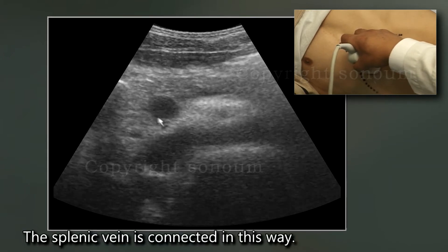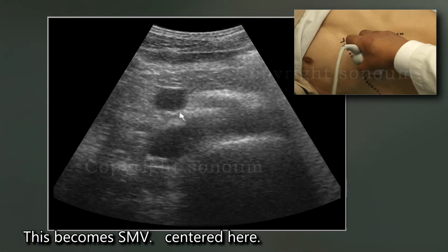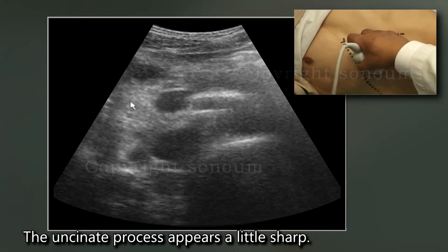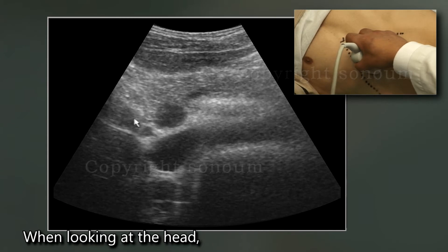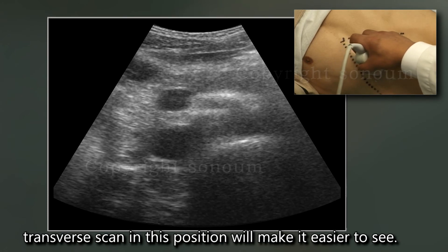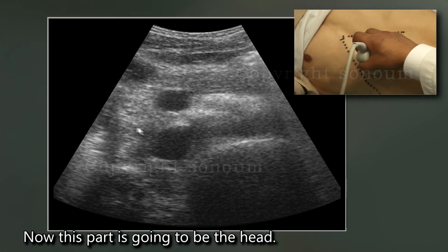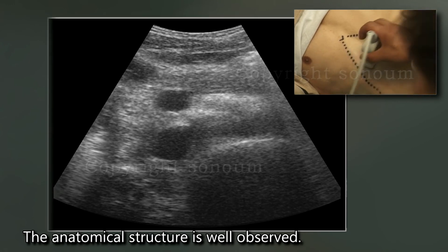This is the head. When looking at the head, a transverse scan in this position will make it easier to see. This part is going to be the head, passing toward the body. The anatomical structure is well observed.